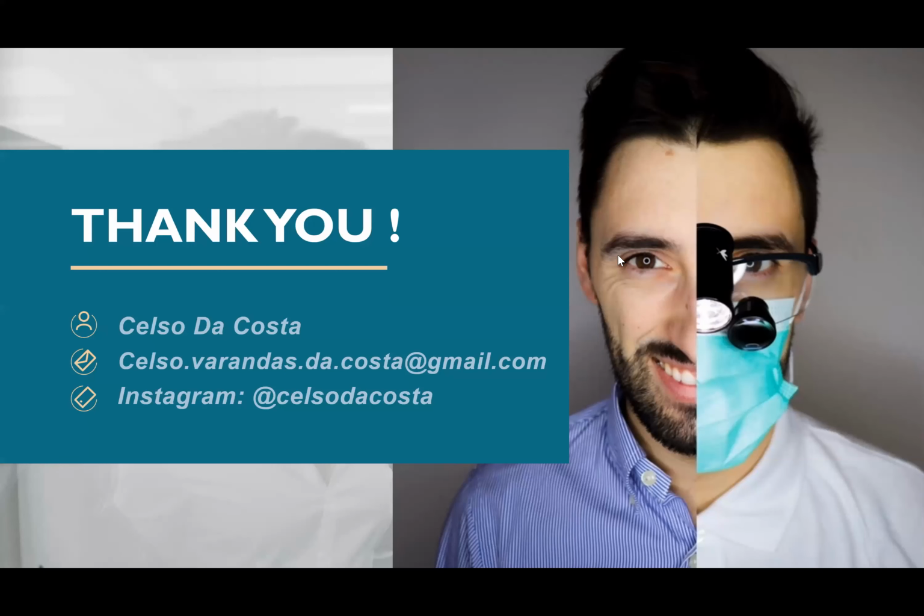Kunta is asking, can I use it one day after the cleaning? Yes, it happens for me sometimes when I don't have an open space in another dental chair, but the patient wants to do it because he's going to leave for the weekend for somewhere. So what I do is GBT one day, and the next day the patient comes, I just do the airflow and do the Click. So I'm going to spend 20 minutes with the patient if we do it the next day. This is something that we can juggle with.